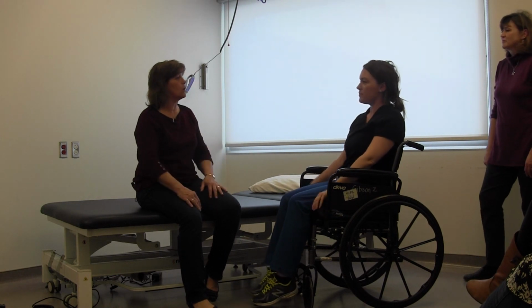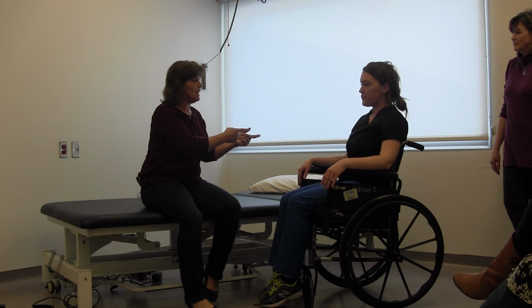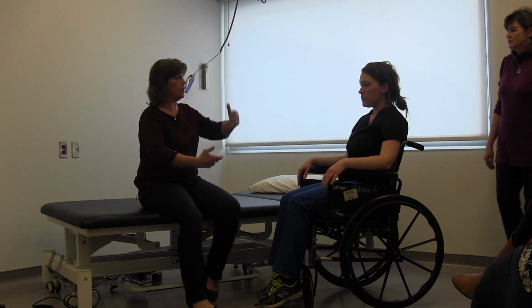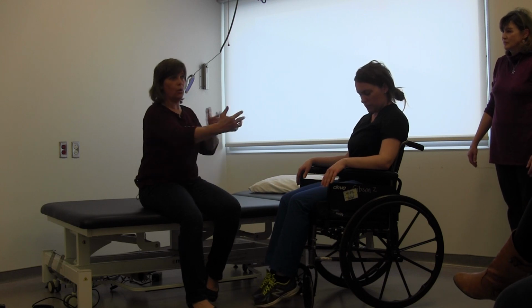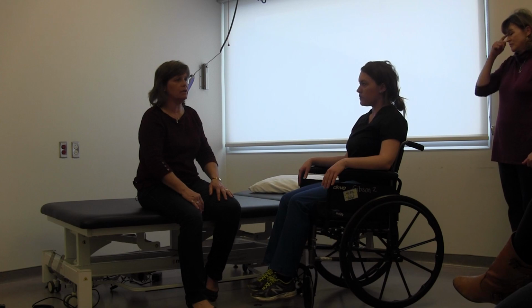Okay, and that's how you can work. Sometimes though, if you can get underneath the client, you still may need that second person behind. So the one person underneath the hip and the trunk, and the second pair of hands where it's needed, either on the torso or underneath the hips, depending on the individual's needs.